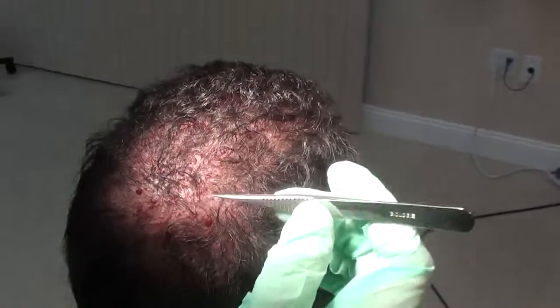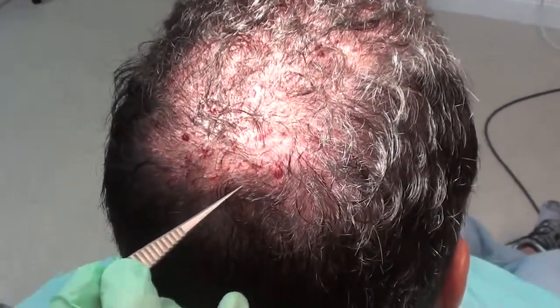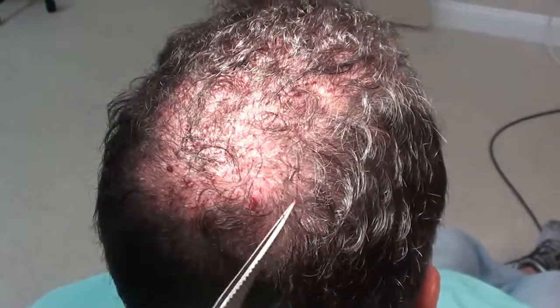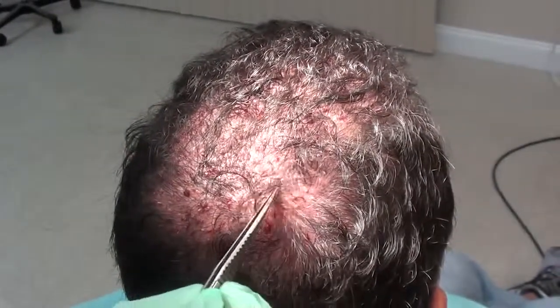And then we went in the crown, and we restored into the crown, built a spiral all the way around. So these grafts came in at an angle going like this. These are going this way. These are going this way. You've got it built all the way in and through the existing hairs all the way around. So you can see those little grafts in there. Those are all little grafts that we put in there.